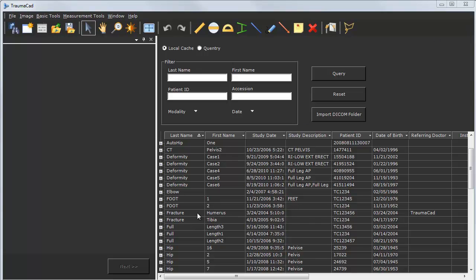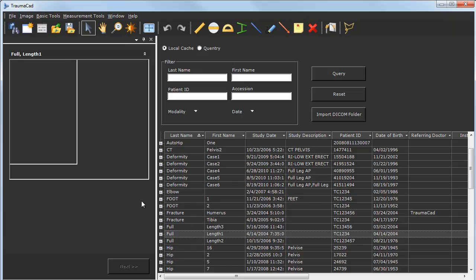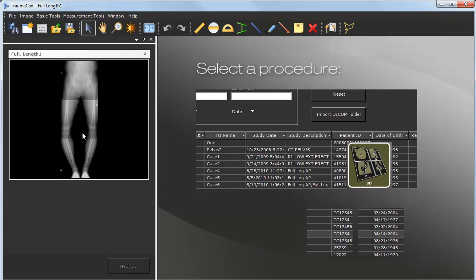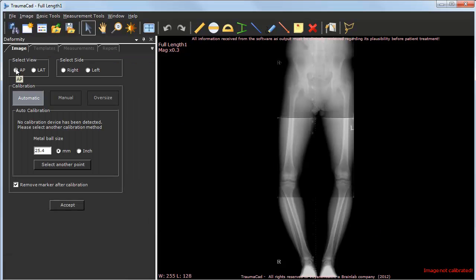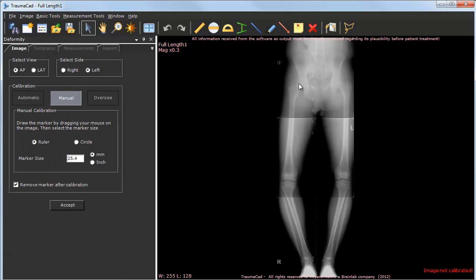To get started, simply select any image from the PACs or any other local storage and you're ready to go. Select the surgical procedure—deformity in this case—and move on to process and calibrate the image.